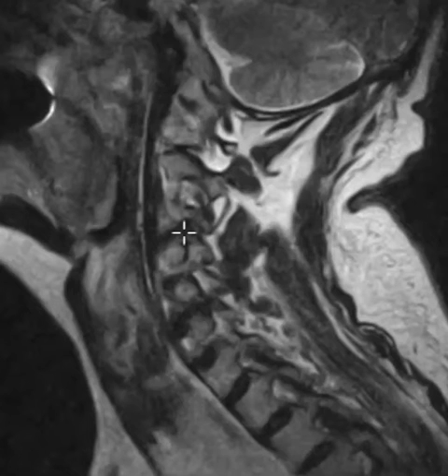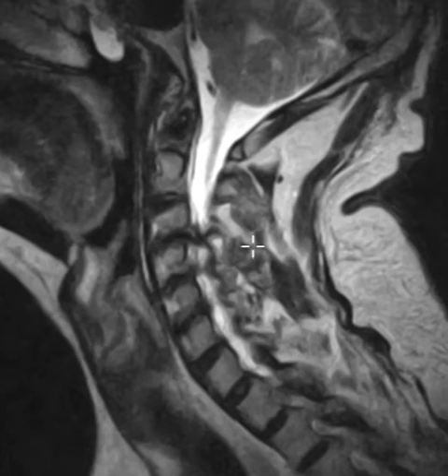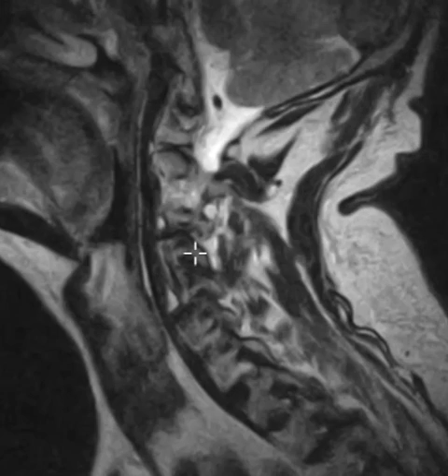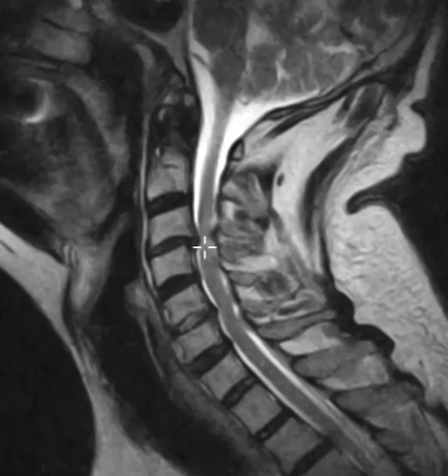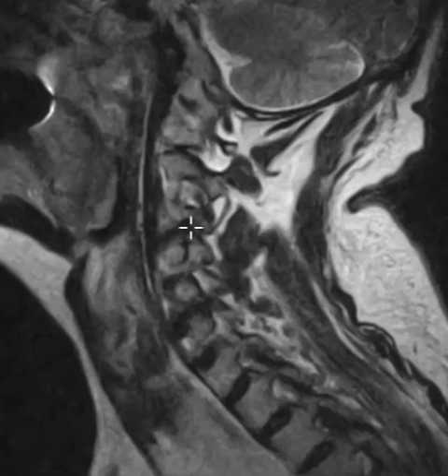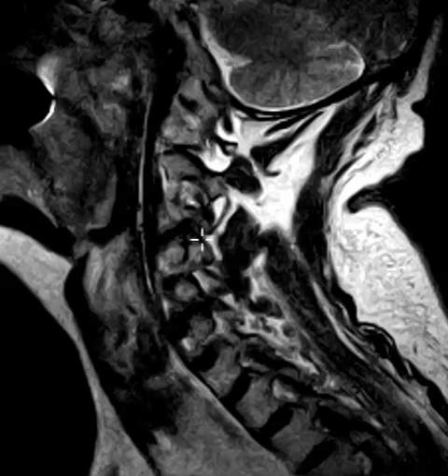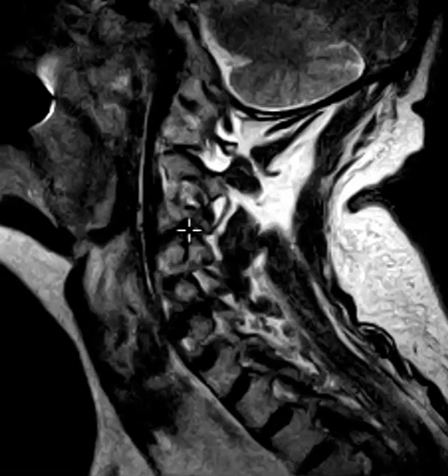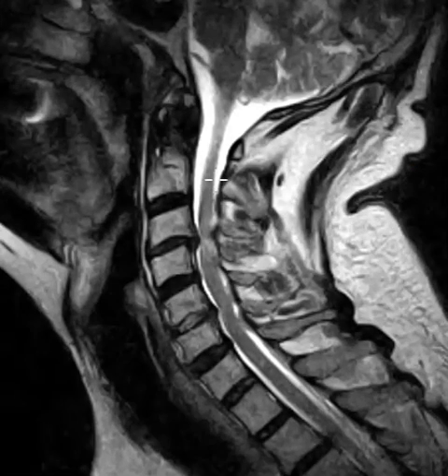If we roll off to one side, we see darkness. This is a severe stenosis in the foramen, which is an opening on the left, and here's the opening on the right. It looks like a bird's beak spur going off on the right, so you have not only a severe central stenosis and compression of the cord, but also severe narrowing of the foramina — the holes where the nerves go out. You can see here's a foramen and a nerve, and here you see just that bony spur causing severe stenosis. So, end stage findings.